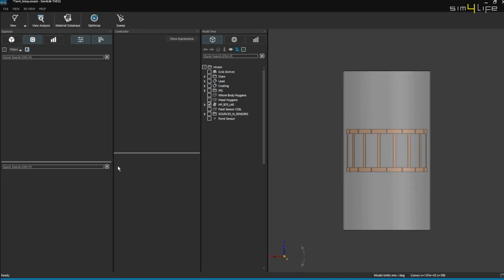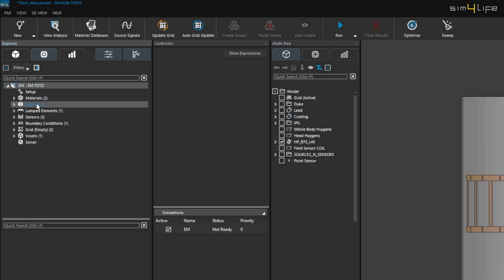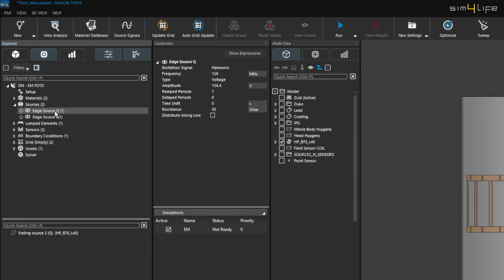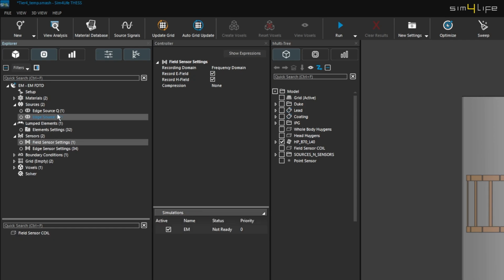We create a single port EM FDTD simulation with a runtime of 320 periods to ensure that electromagnetic fields fully evolve and the simulation reaches convergence. Starting with the RF coil in an unloaded state, we generate the baseline MRI exposure field using all predefined configurations for the specific coil. This includes voltage amplitudes of the edge sources and capacitance values of the end ring capacitors, calibrated for a 3 Tesla MRI RF exposure.